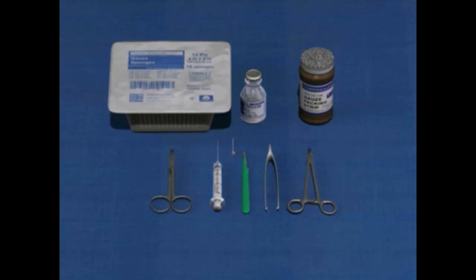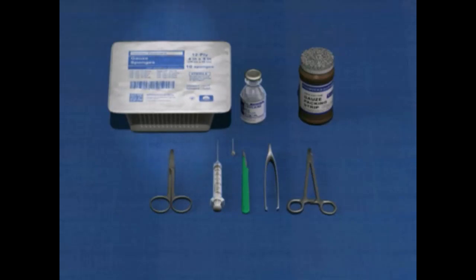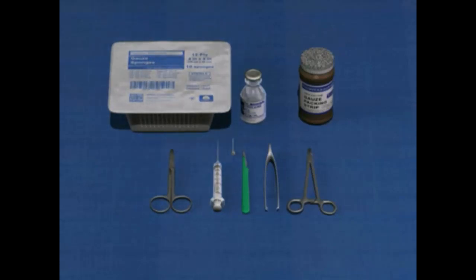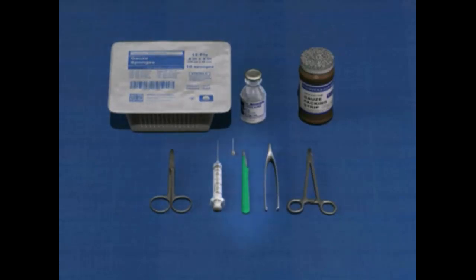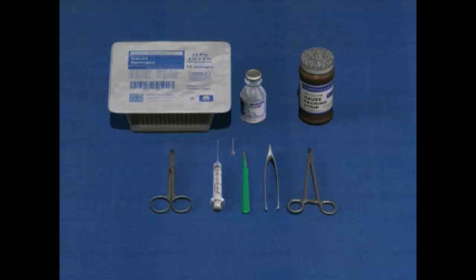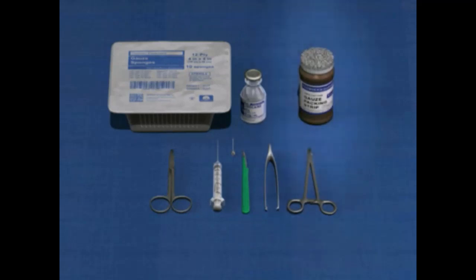Additional equipment includes an alcohol or povidone-iodine wipe, 4 by 4 inch gauze, a number 11 or 15 blade scalpel, curved hemostats, packing gauze, and wound culture materials.